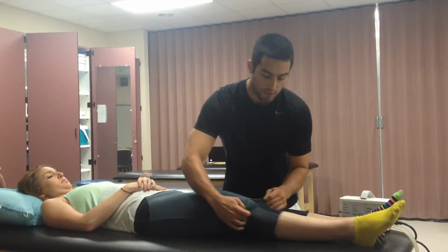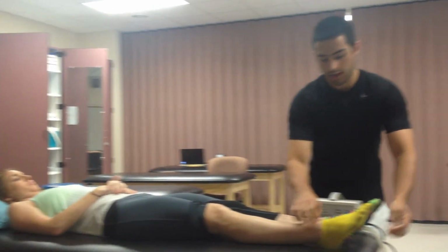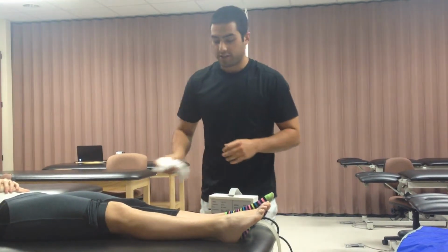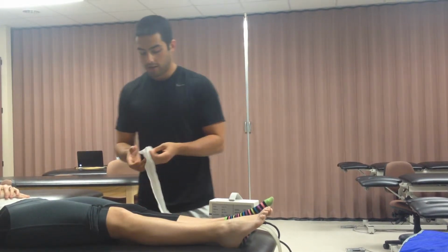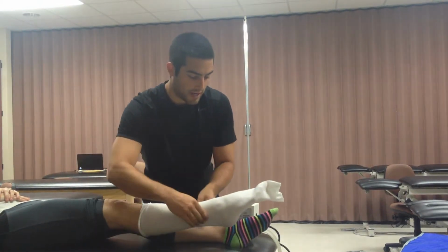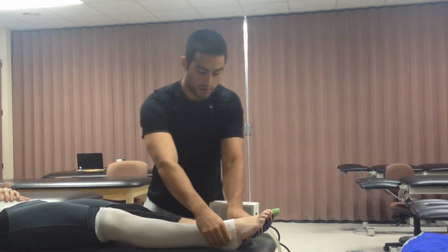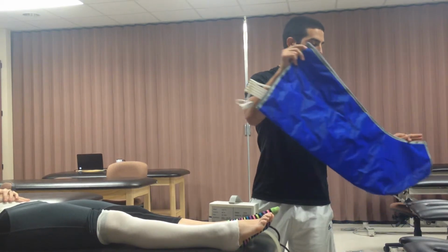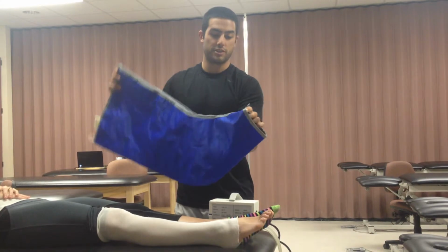I'm going to first pull up the patient's legging and remove her sock. I'll make sure that the area is clear and there's no jewelry in the area. I will then apply a compression garment underneath the actual sleeve for the intermittent compression and make sure there's no wrinkles in the compression garment. Now I can apply the actual sleeve for the intermittent compression unit.